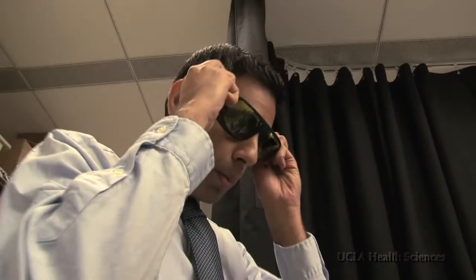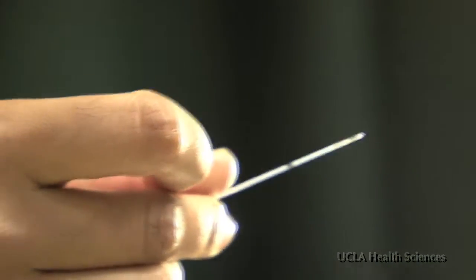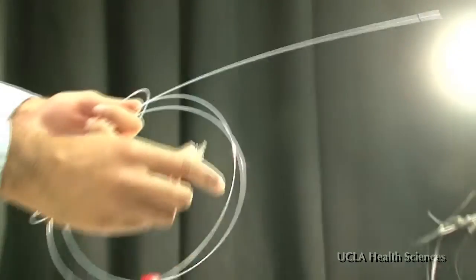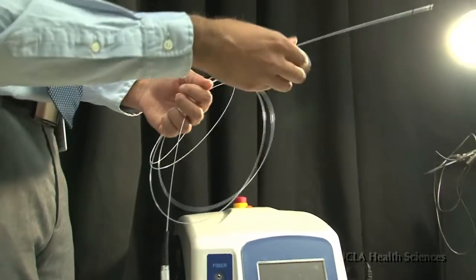Laser energy is used because the treatment ablation of tissue is precise and the fibers are tiny, able to fit through conventional needle guides. Ablation means we apply laser energy, or heat, to the tumor so that the cancer cells will die.